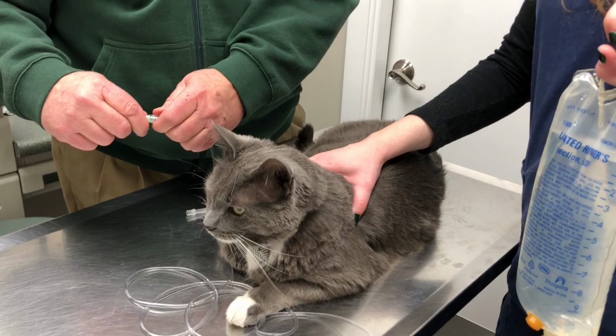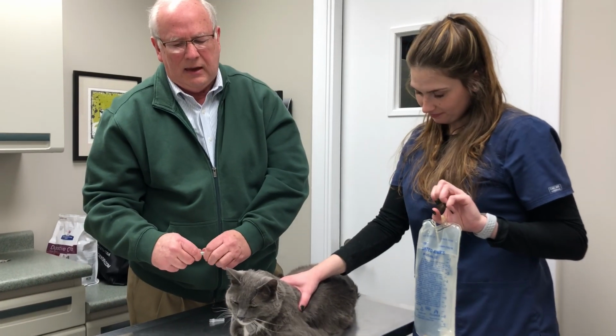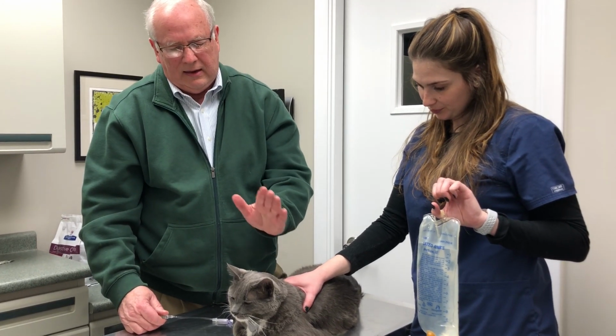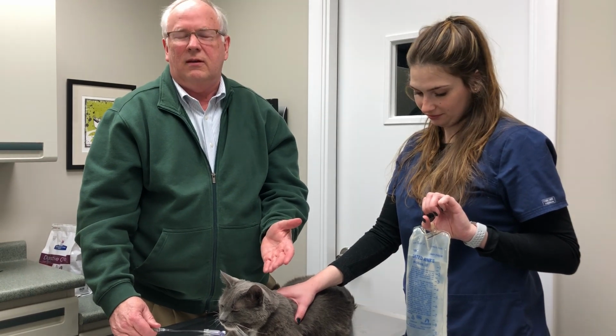So I hope that video helps in giving subcutaneous fluids to your cat. And again, I always recommend doing it around mealtime so that they feel like they got a reward for sitting there while they have their fluids done.